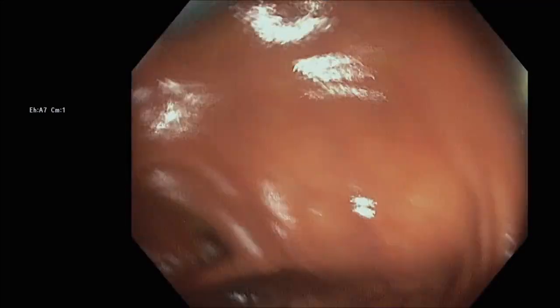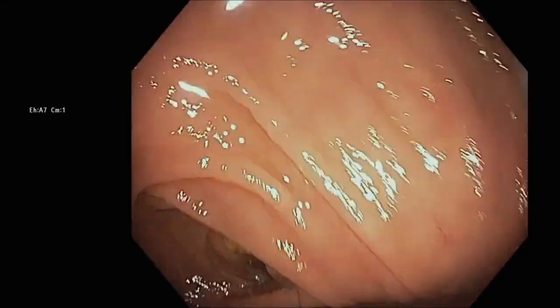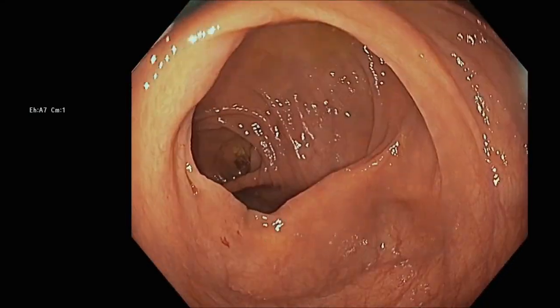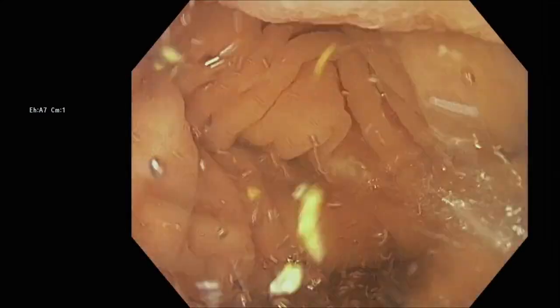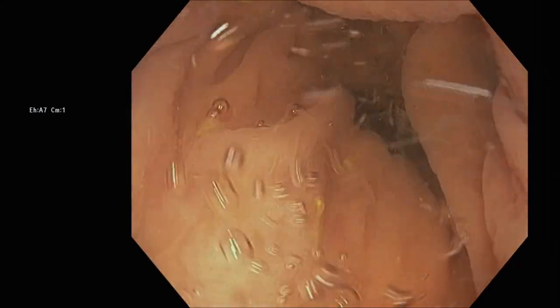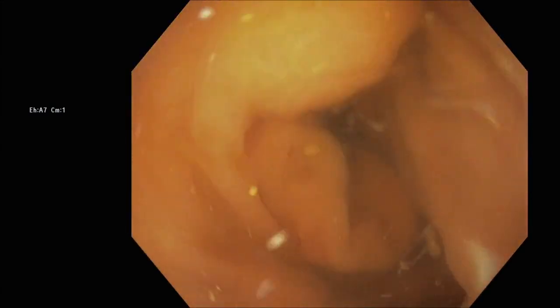Here's another case of underwater intubation of the TI. And when you're using this technique, it can help to clean up a bit first, because if there's a lot of mucus around and you start to infuse water, it can get a bit cloudy. It's possible to lose track of the valve. You can see now with this clear water, we can already see the valve turning out. Everything is relaxing. And we came past the valve.